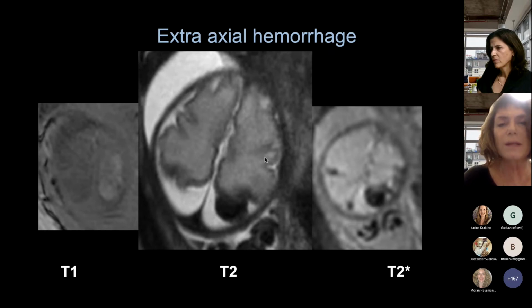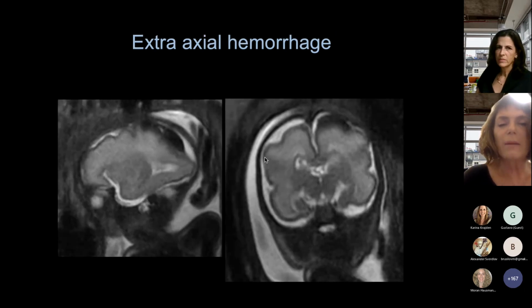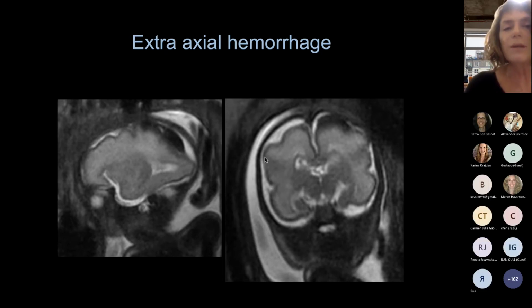This is an intrinsic advantage that you can see by the T1 weighted images and the T2 star weighted images, seeing what really are some of the tissue components. And we can also identify it because of the 3D aspects of it. You can see that in the same patient, it's more likely extraaxial, but probably a sub-pial, which is a very unusual hemorrhage in the neonate.